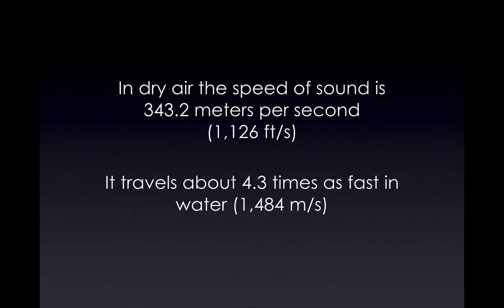And again, water is a denser medium, because we talked about that medium disturbance. If you think about it, water being a liquid is denser than air, which is a gas, obviously. And in a way, molecules are packed tighter in water than in air. So it just travels faster.